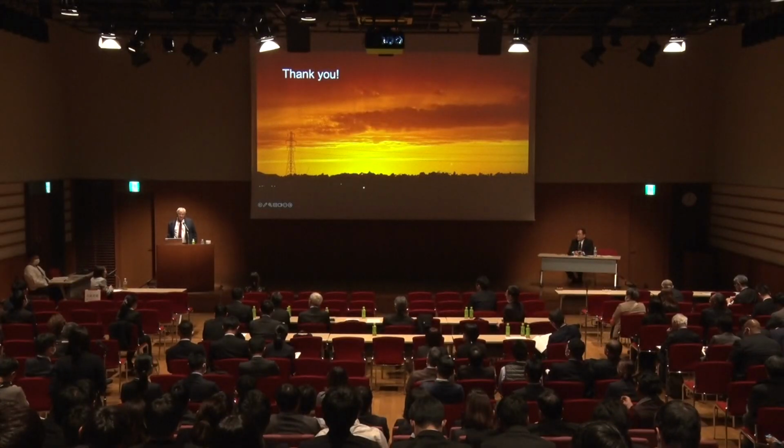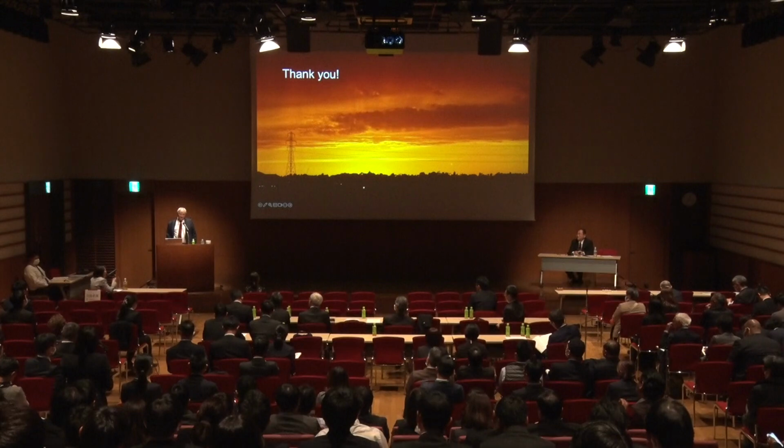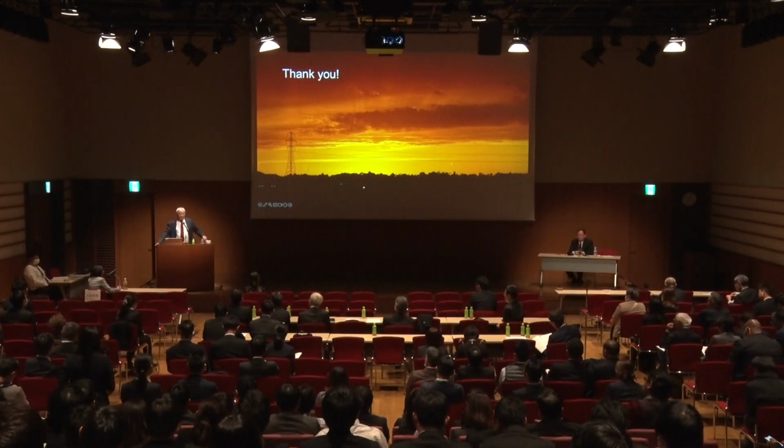Unfortunately, it only gives us clues. So it very accurately tells us the leg and the level of lameness, but not the exact site. So we need to use other techniques to confirm the site. But it can give us clues because of the nature of the lameness, push off versus impact.